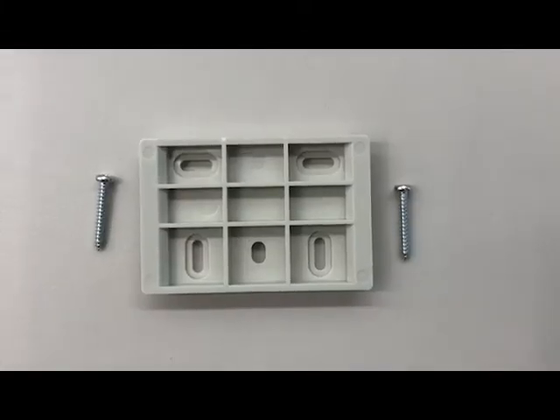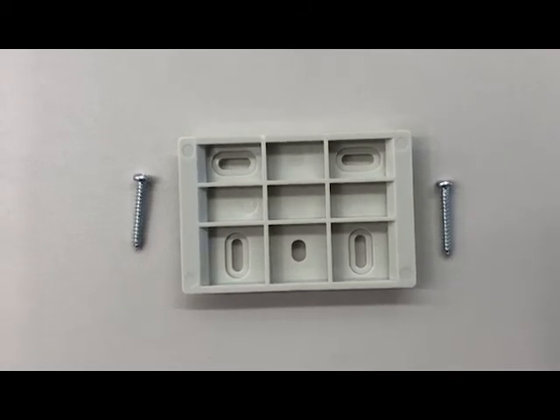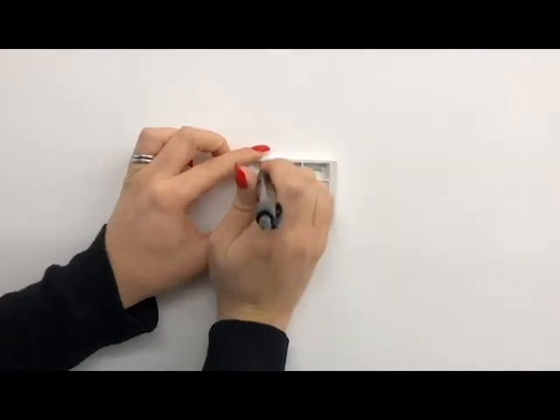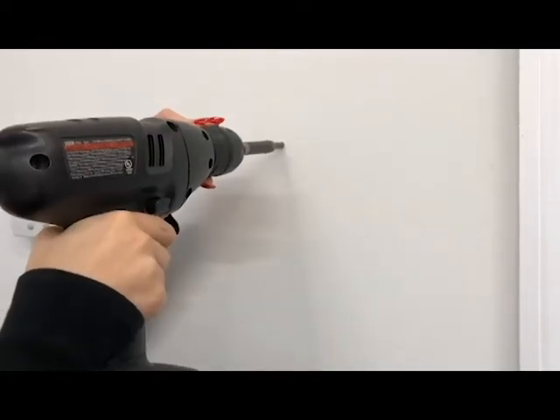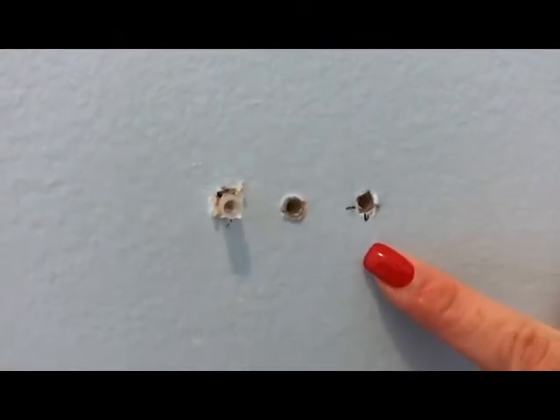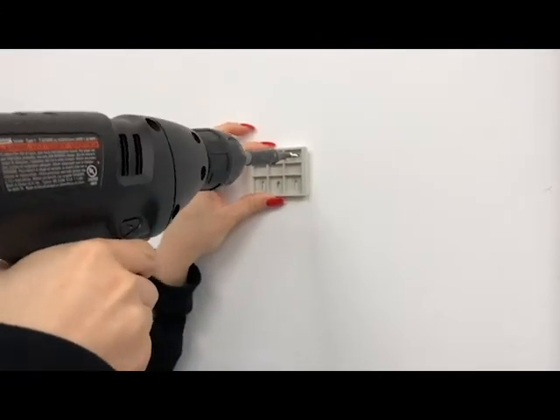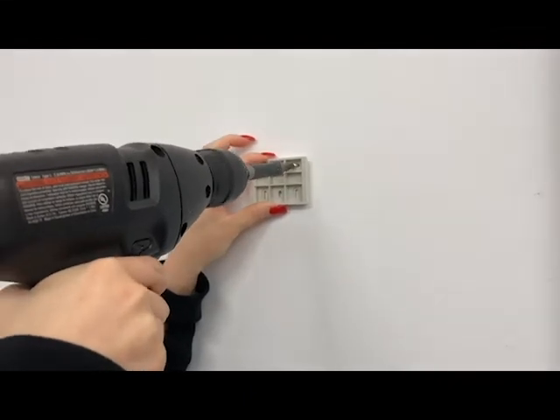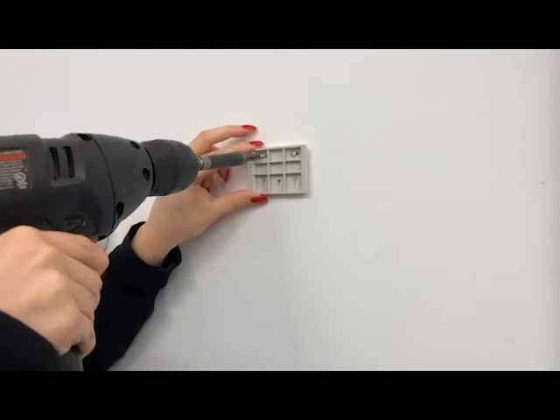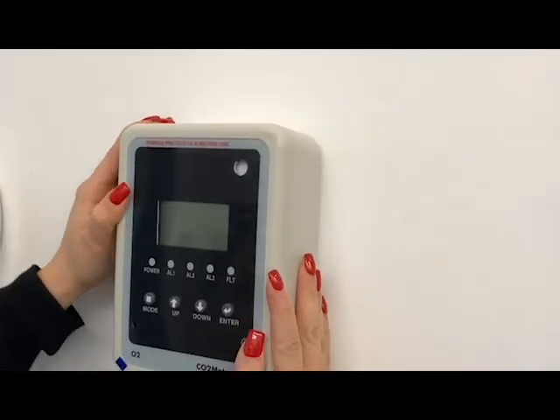Next, attach one of the mounting brackets to the wall, utilizing the provided screws and drywall anchors. Use the mounting bracket as a template to mark placement for holes. Once the placement has been marked, drill holes accordingly. Then insert clear wall anchors into the holes and ensure they are flush to the wall. You will then screw the mounting bracket to the wall. Now slide the main sensor unit onto the mounting bracket.